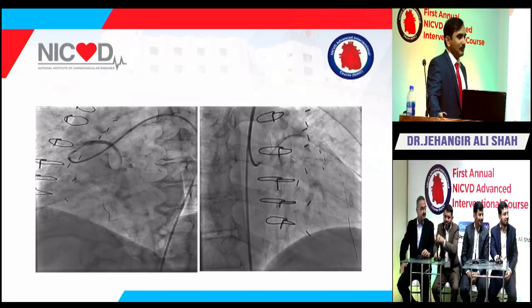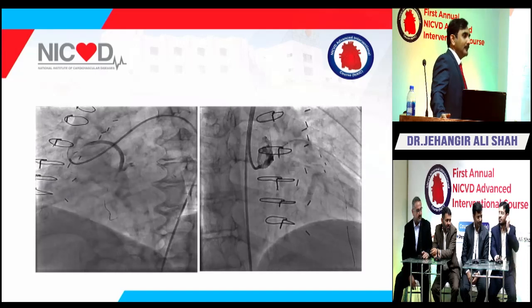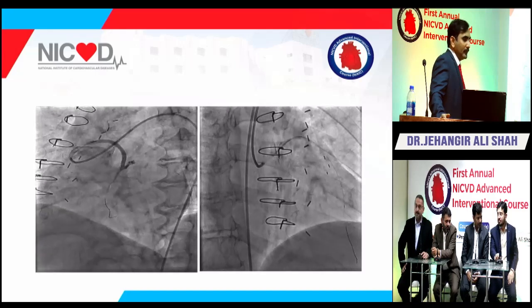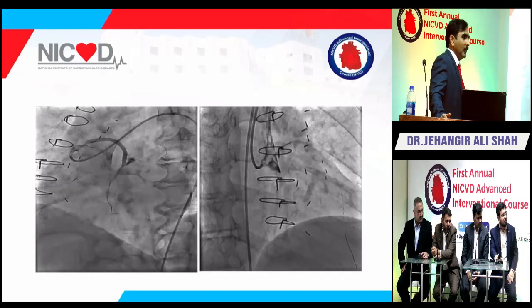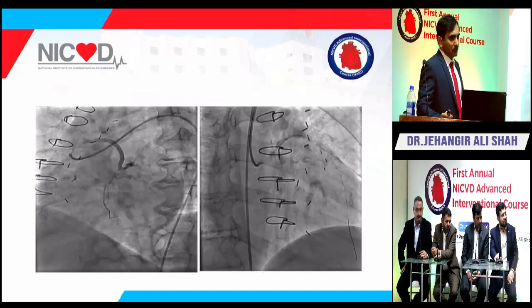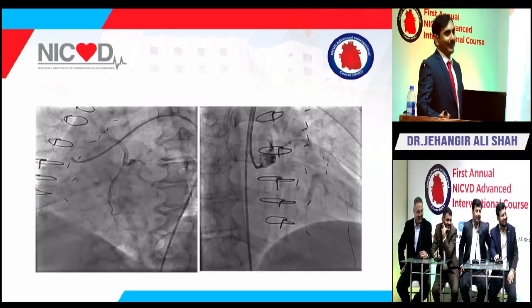So the question was, would IVUS help in this case? I still have to think of a lesion where IVUS would not help. So that question in itself is an oxymoron. IVUS will always give you more information. We have cost constraints, so that is the only reason. It was rare in the US for me to do a PCI outside of an acute MI without IVUS, because cost was not an issue. Now, if I told you that you can use IVUS just like you use a 2.0 by 15 balloon, you would be using up IVUS catheters, okay?